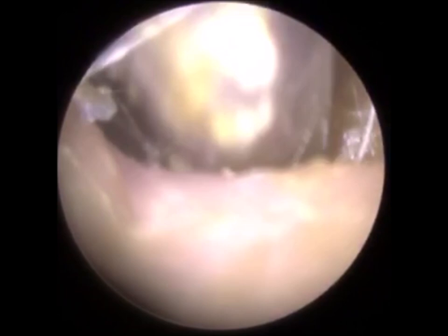And as the patient's wife stated at the beginning of the video, the patient's now a human being, he's back in the land of the living. So this is some of the still images. You can see just how much we removed. You can see all the instruments we used: suction probe, Hartmann forceps, ear hook, St Bart's ear hook, a fine end. We went through the whole repertoire of instruments there.